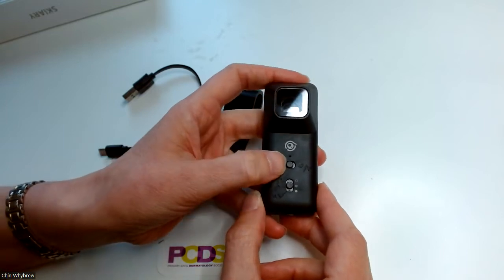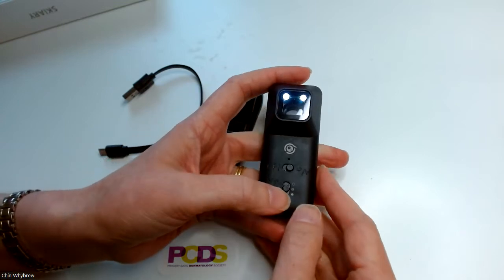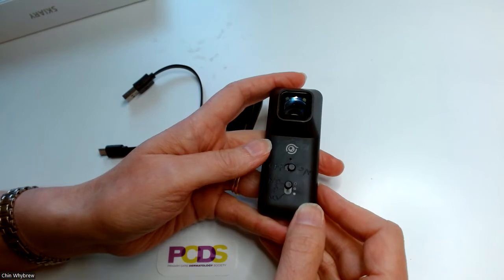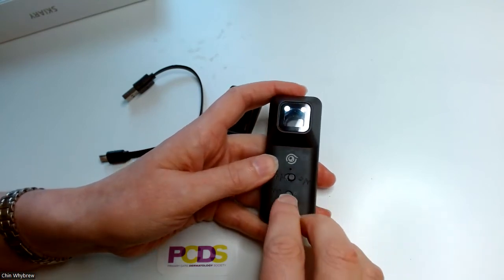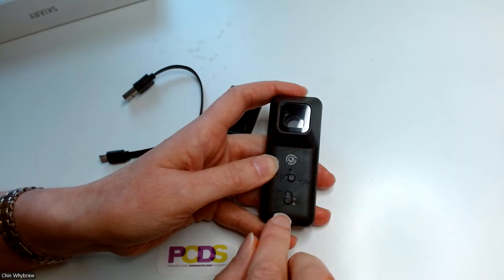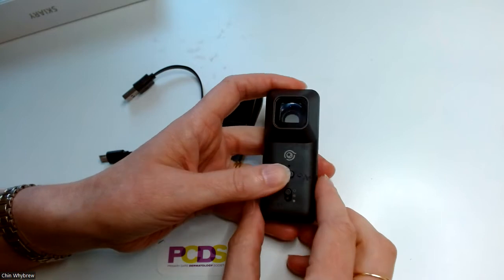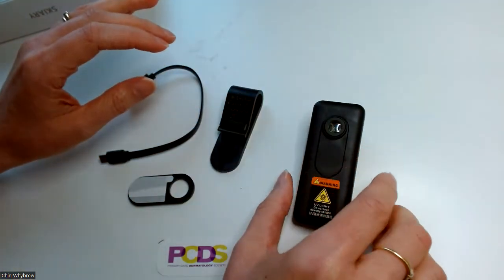To turn it on is this top button, and you see that turns it on. And then we have this bottom button here, which has 3 positions. The top position is non-polarized, the middle position is polarized, and the lower position is actually ultraviolet light. I'll put it back to the top one for now. I'm actually just going to turn it off momentarily.